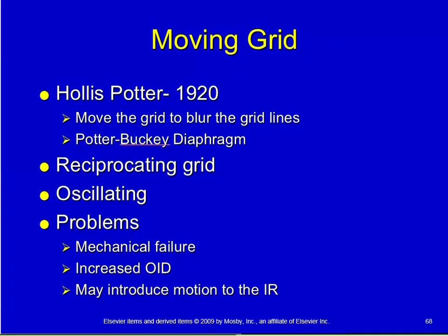And if the motion of the grid is too significant, then it can move, usually not the patient, but usually the table itself. So if it moves the table, or more specifically the image receptor, you may introduce motion on the image receptor.